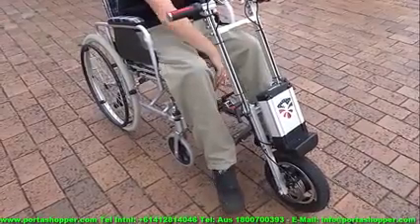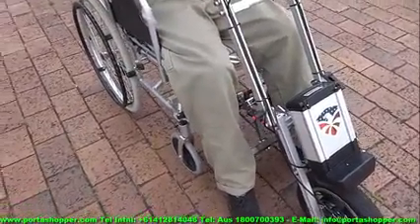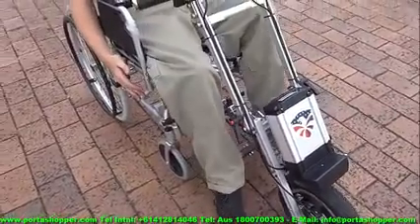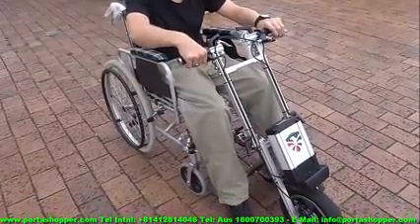Remember to pull the brake lever of the Porter Wheel in sharply and keep it engaged to make it easier to screw the safety bolt in. Remember that once it's hooked up, you can actually let go of the brake, but holding the brake in just relieves the tension to make it easier. Disengaging is very easy, and you simply follow the steps in reverse.